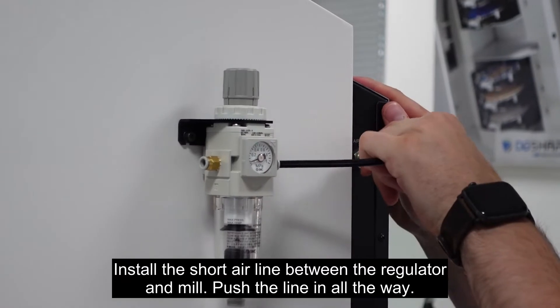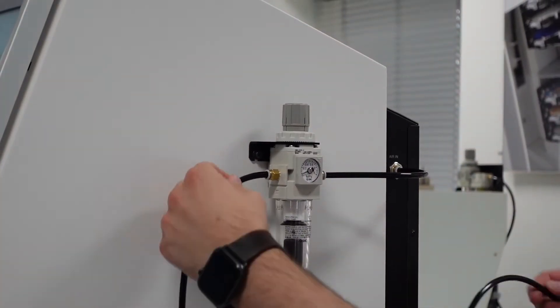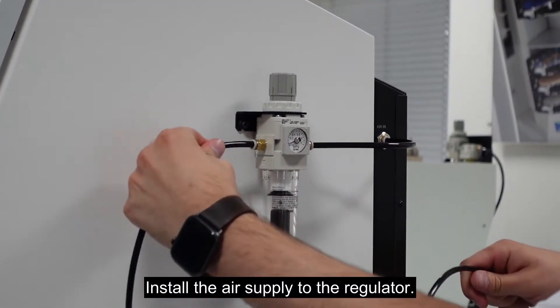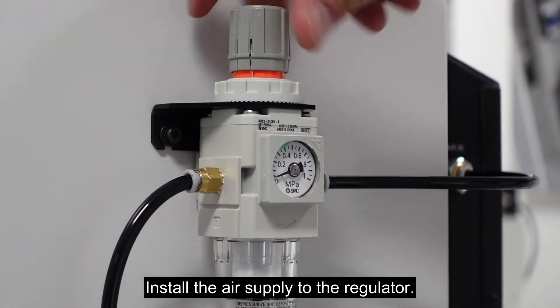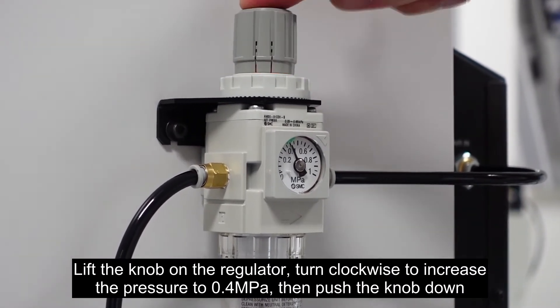Push the air line in all the way. Install the air supply to the regulator. Lift the knob on the regulator and turn clockwise to increase the pressure to 0.4 MPa, then push the knob down.